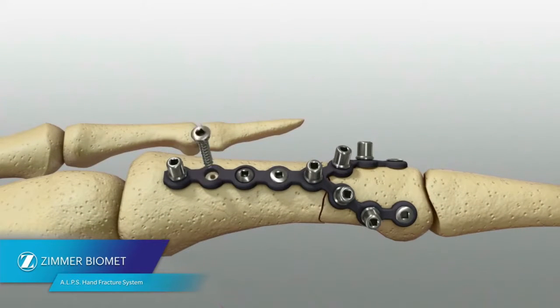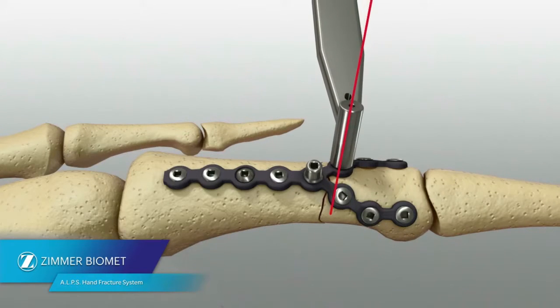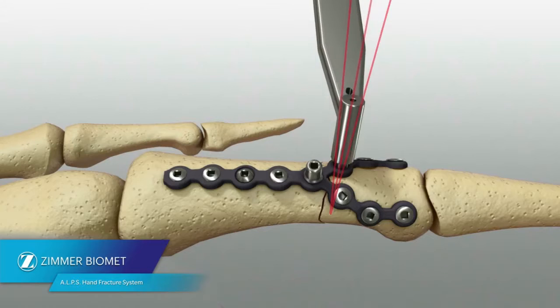When using a multi-directional screw, remove the fast guide prior to drilling. Drill through the soft tissue guide with appropriate drill in the desired direction. It is recommended that the hole is not drilled more than 10 degrees off axis.